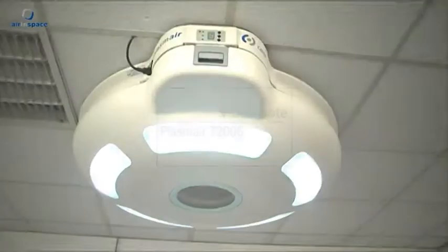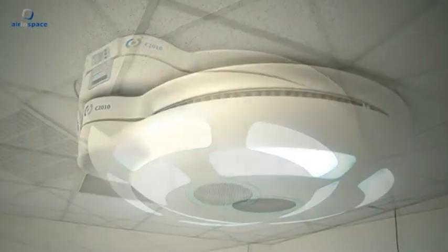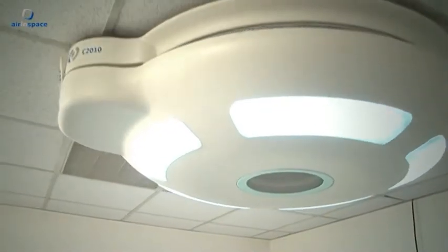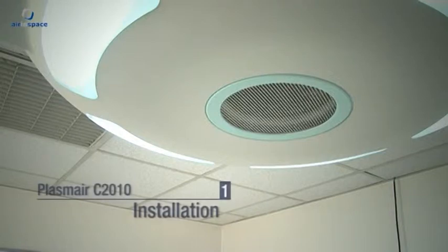The Plasmair C2010 is an air decontamination sealing unit, a tool for controlling air quality and for combating nosocomial infections. It draws room air in, processes it and then expels the clean air back into the room.